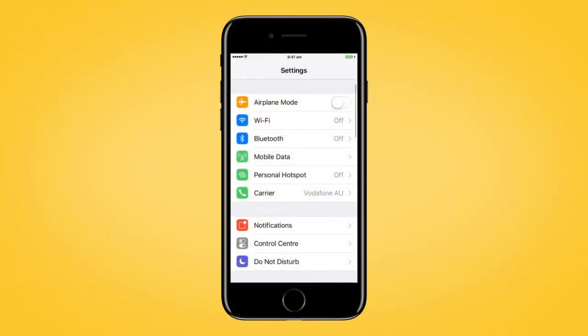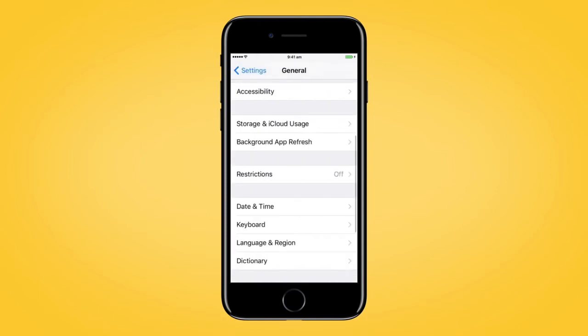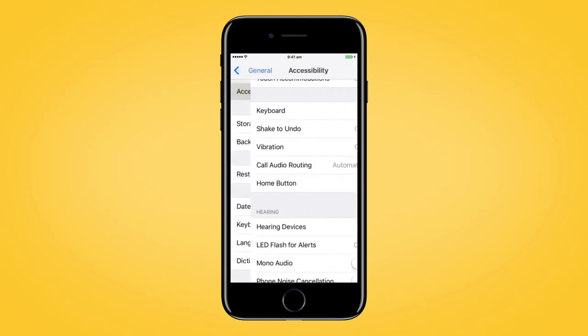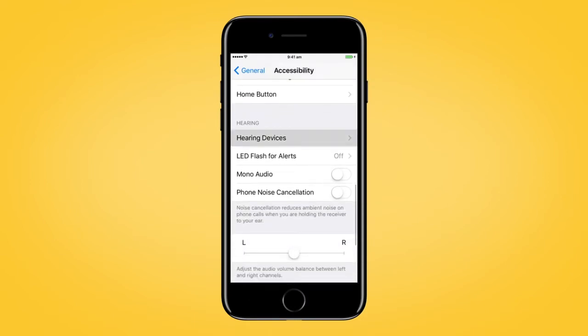First, go to Settings and tap General. Then, Accessibility. Scroll down and select Hearing Devices.